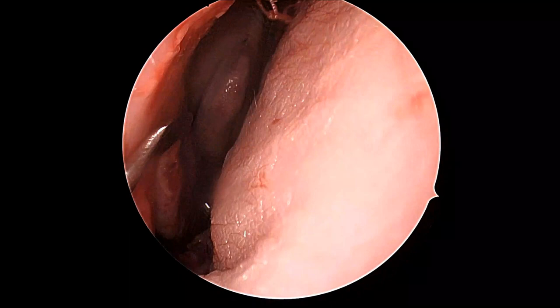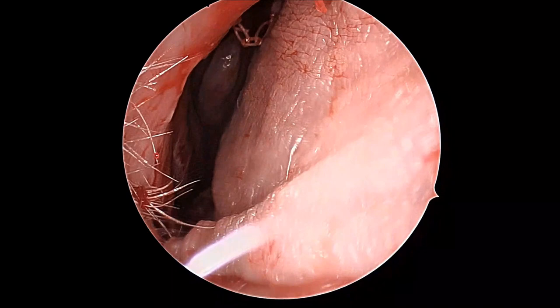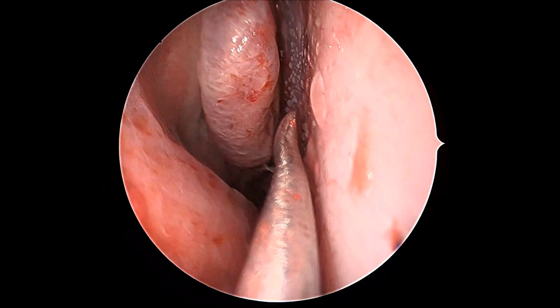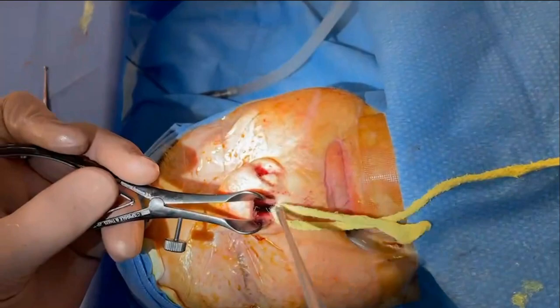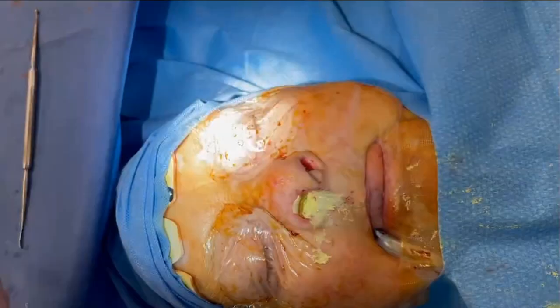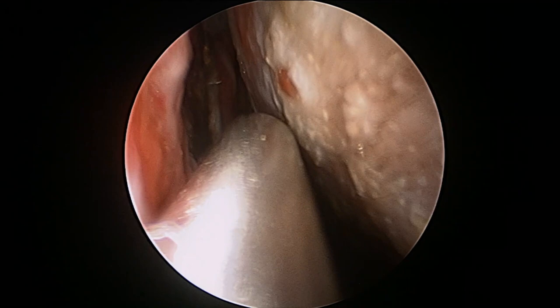There are very few other sutures. Here is the final graft approximating the squamous mucosal junction. A silicone sheet is placed over this and held in place with three 4-0 prolene sutures. Finally, on the side of the graft, a BIP or xeroform gauze is used to pack this cavity, leaving the contralateral nasal passage open. The patient is managed as a day procedure, and in a different patient shown at follow-up, the BIP was removed at one week, the silicone sheets at six weeks, with great coverage and silver nitrate used to touch up small areas.